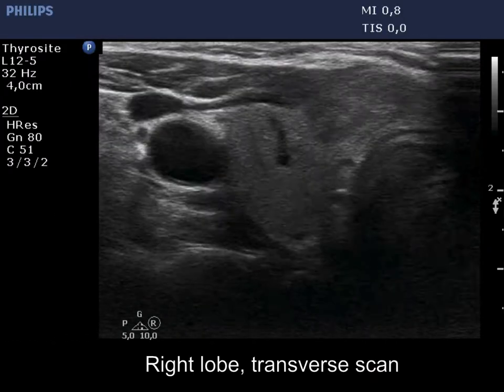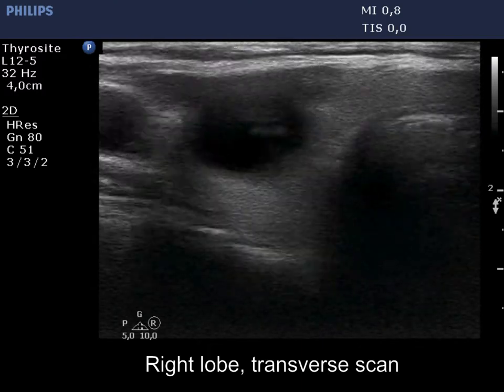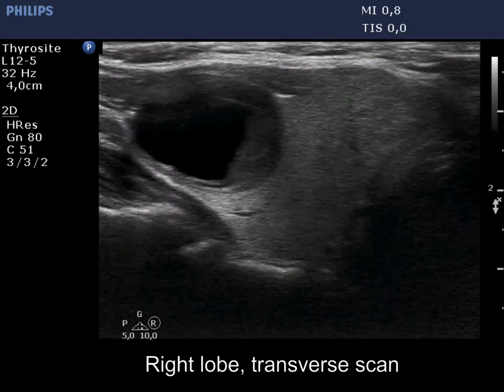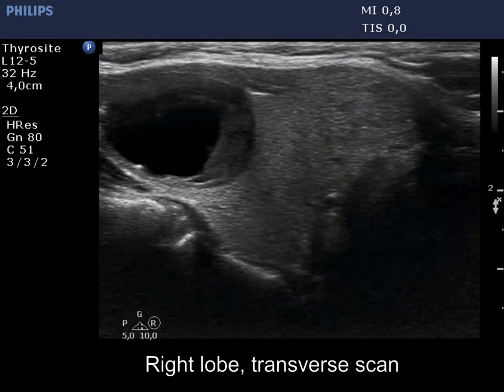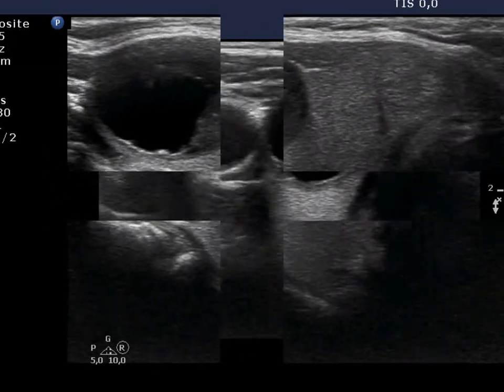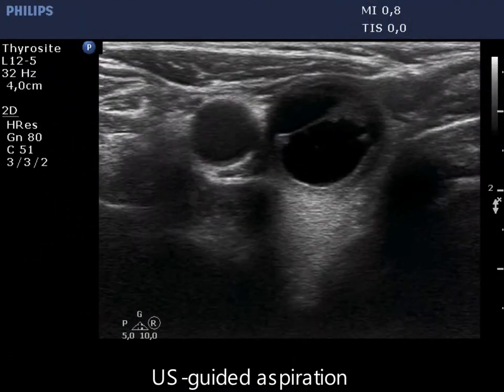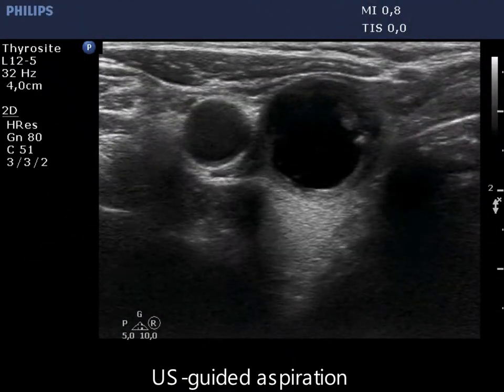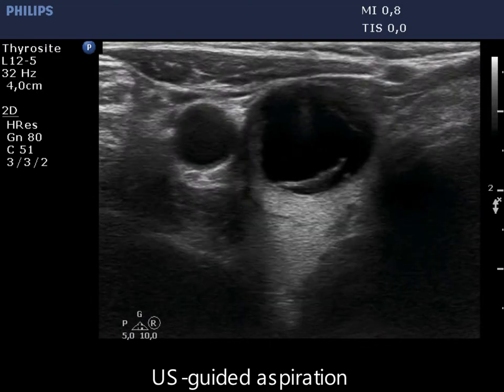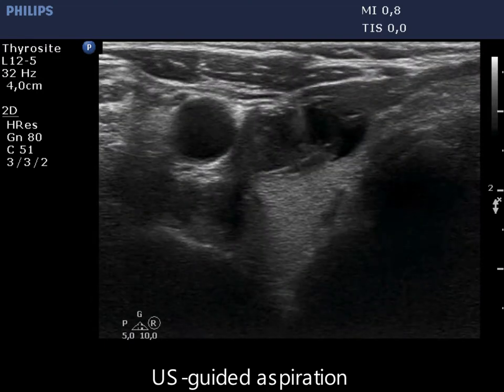There is a central type cystic nodule having minimally hypoechogenic solid parts. The nodule has regular borders. 3 mL of cystic fluid was removed during ultrasound-guided aspiration.